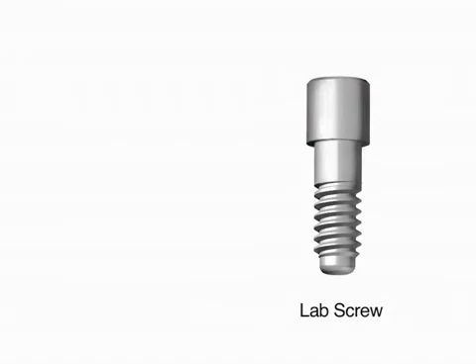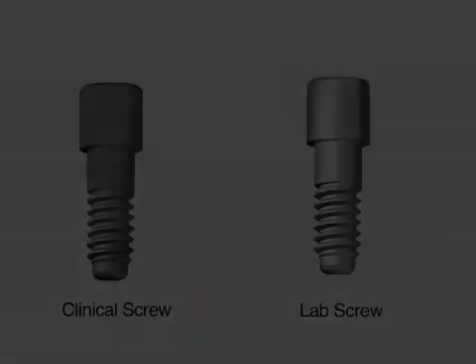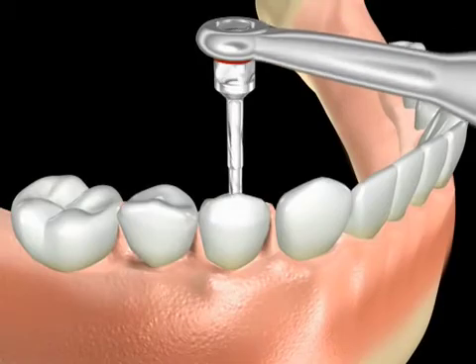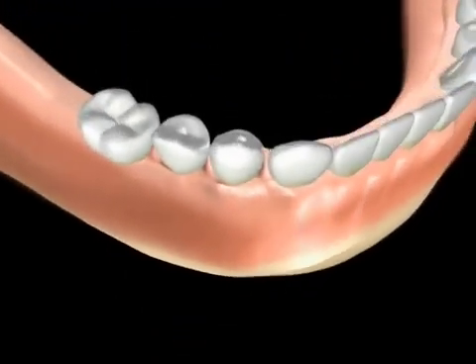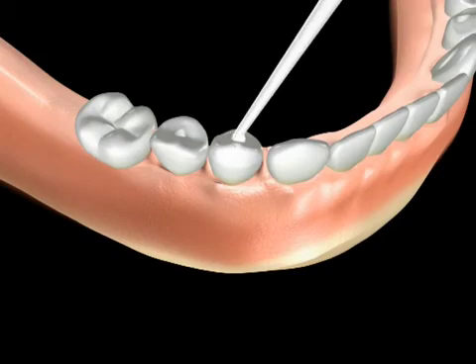At the moment of delivery at chair-side, the screws used at the lab are discarded and clinical screws featuring a special surface treatment for anti-galling are used. The completely passive simultaneous fit of the bridge is confirmed and the clinical retaining screws are secured with 20 newton centimeters of torque. A pellet of cotton is then placed over each screw, followed by composite resin, which is polished upon setting. The occlusion and aesthetics are then finalized and the case is completed.